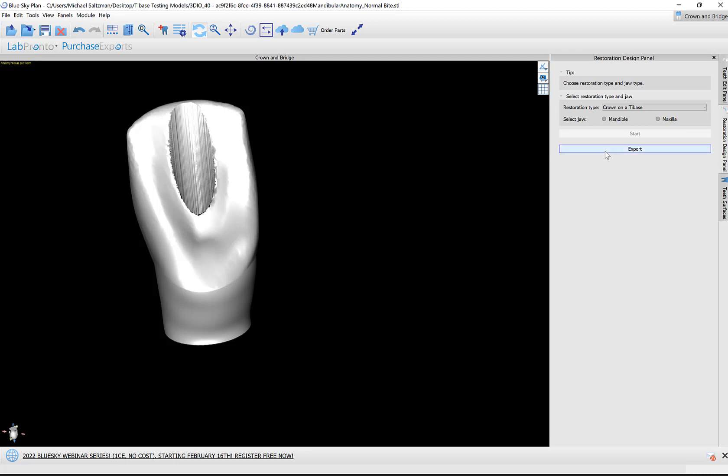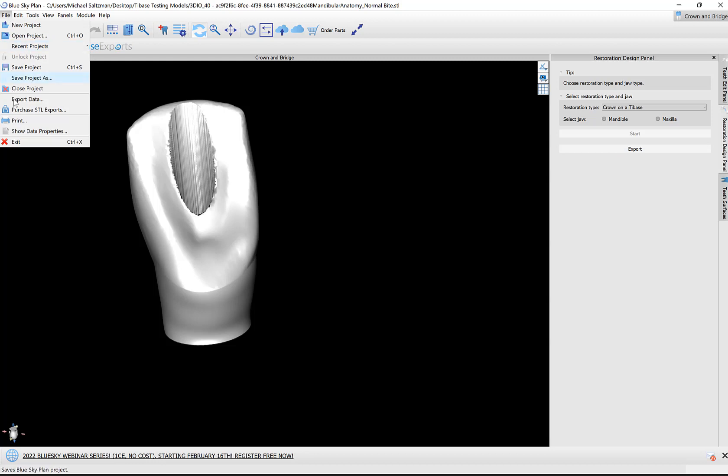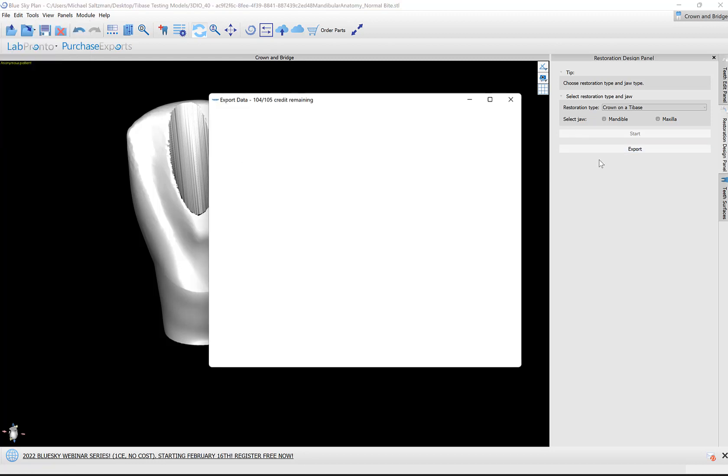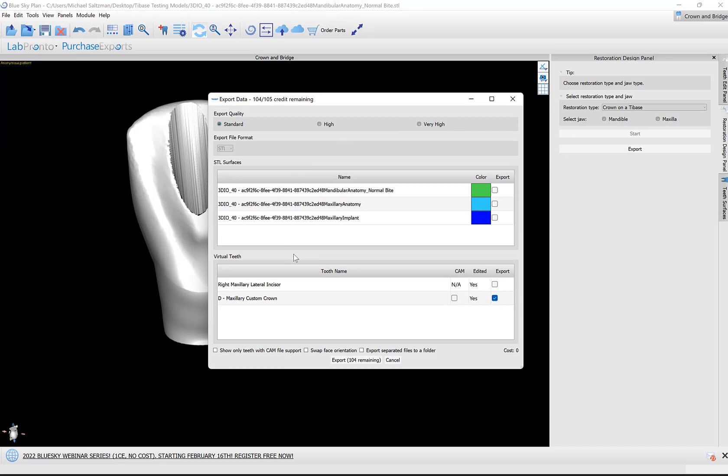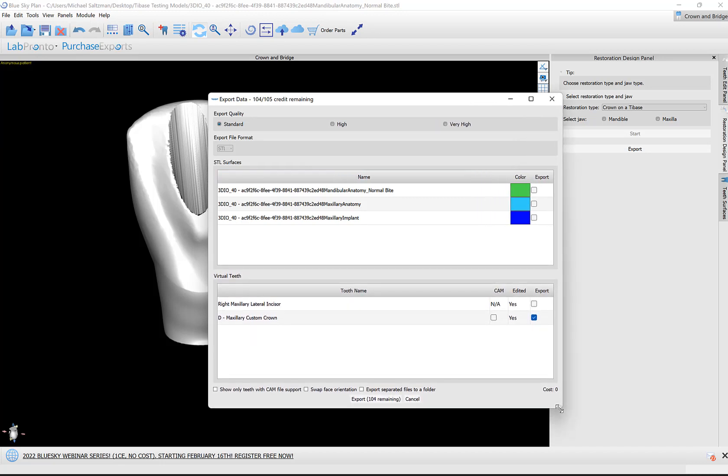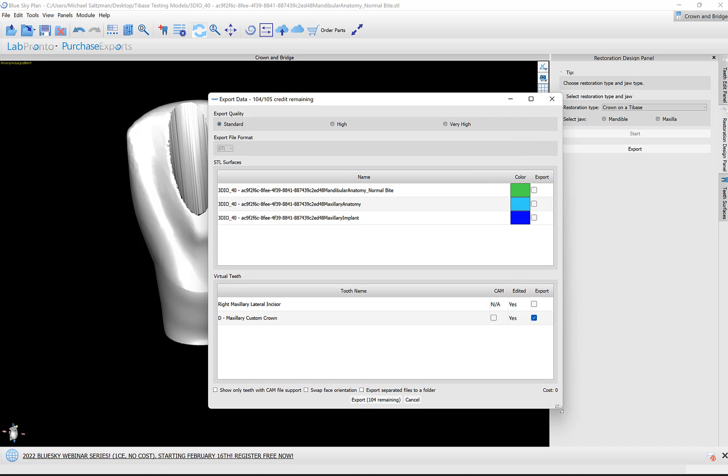I could go ahead and click the export button. I can also access File > Export Data as always. If I click export—and again these exports from Crown and Bridge are completely free—here are some of our options. We have the quality of the data file that's being exported to STL: standard, high, and very high. Standard or high, totally sufficient.